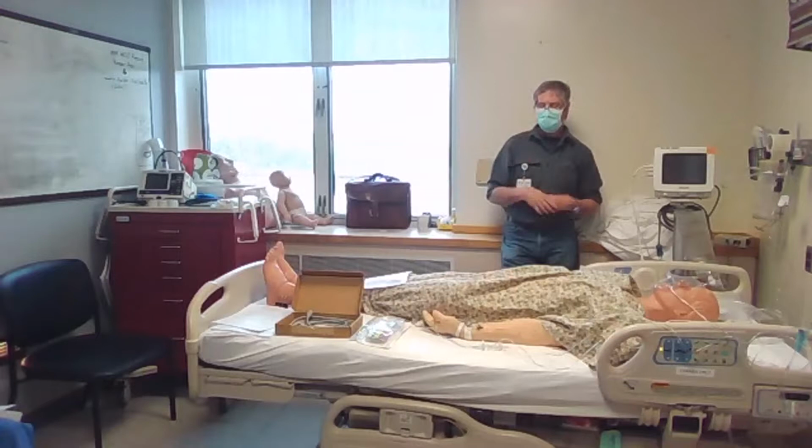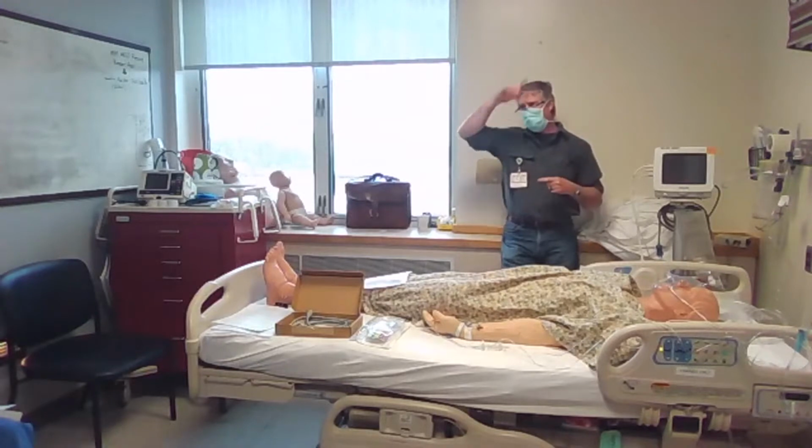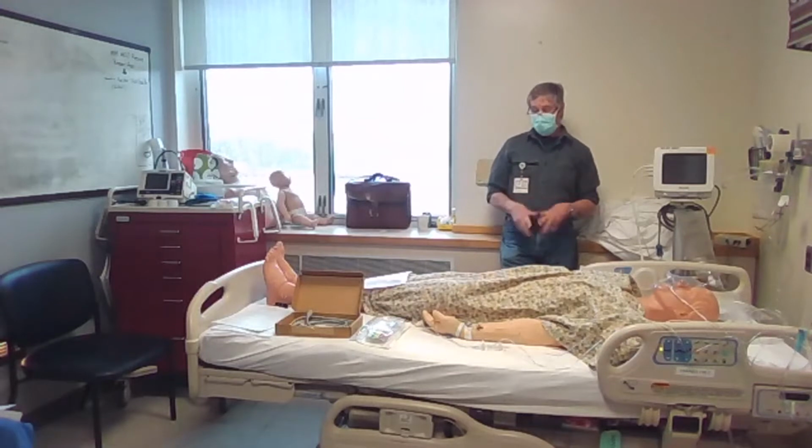So if all of a sudden we're in a surgery and we've got an A-line in, and it's a big vascular surgery like a AAA, and they get the aorta and they lose control of it, you're going to see the blood pressure in the A-line, those waveforms just go zig, zig, zig, zig, down to nothing. And you can see it happening. You jump up and you go, what the? And they're like, yeah.